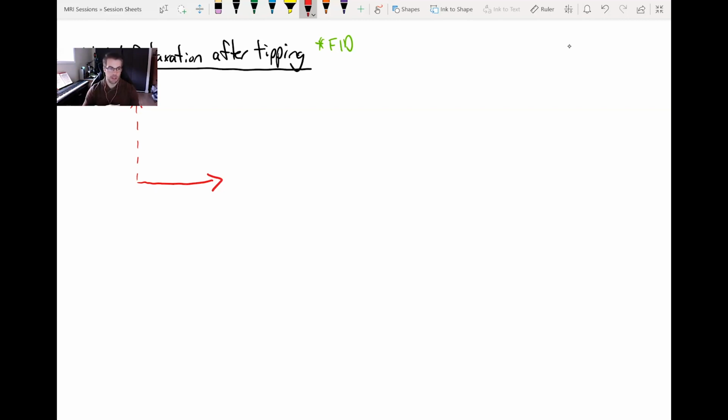But in reality, the B1 field is applied in a bit of a bandwidth. So there is some effect on frequencies above and below that Larmor frequency, which is a whole other topic. It's not actually in reality one specific frequency.